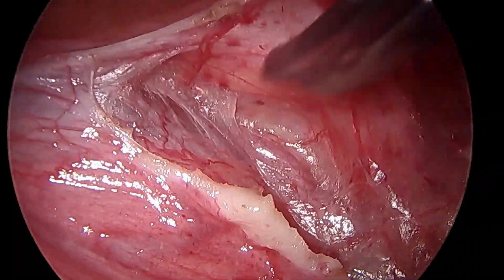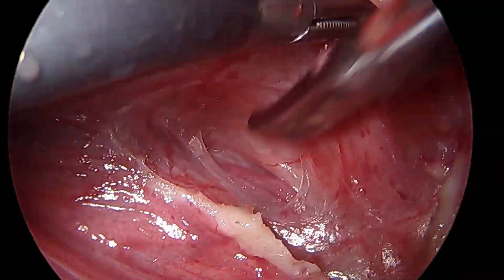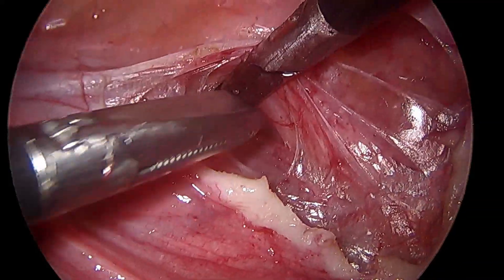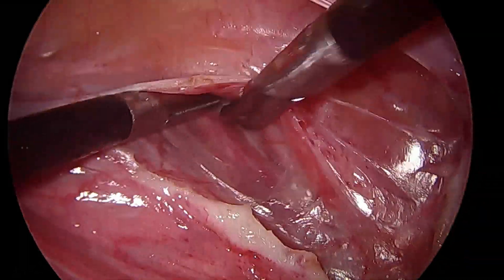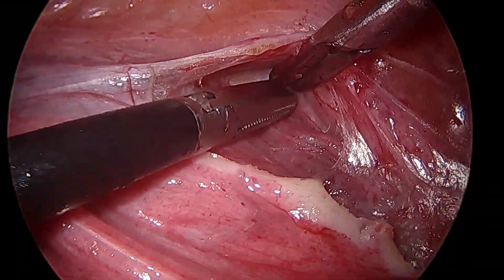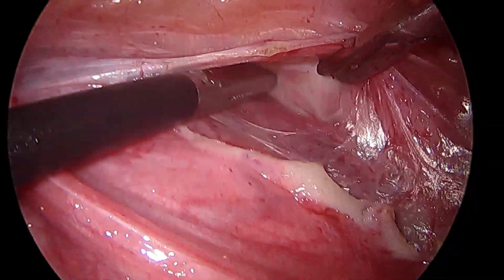You can see the differences. Here, in the lateral window, you are not going there and getting this. That is it. I am just looking at my instrument and everything to do it now.